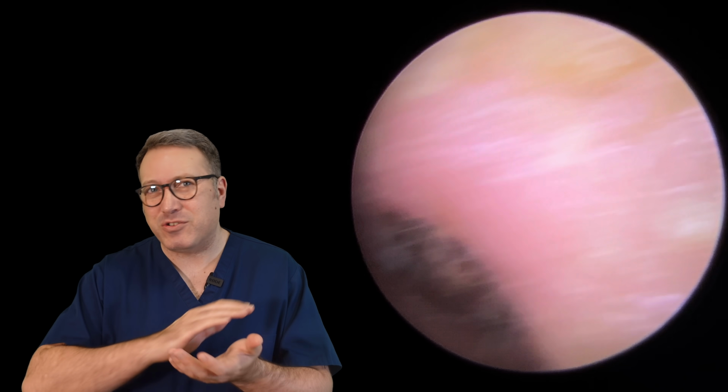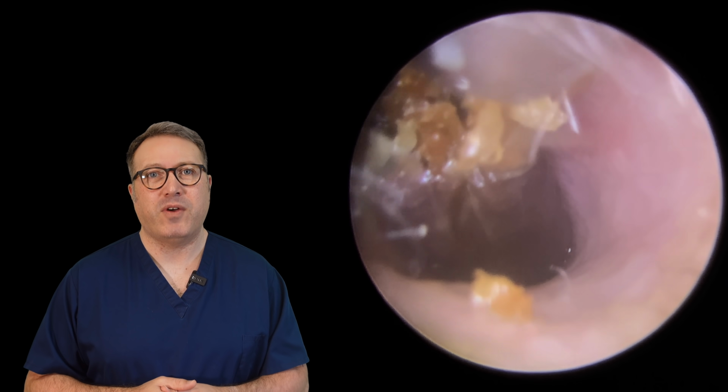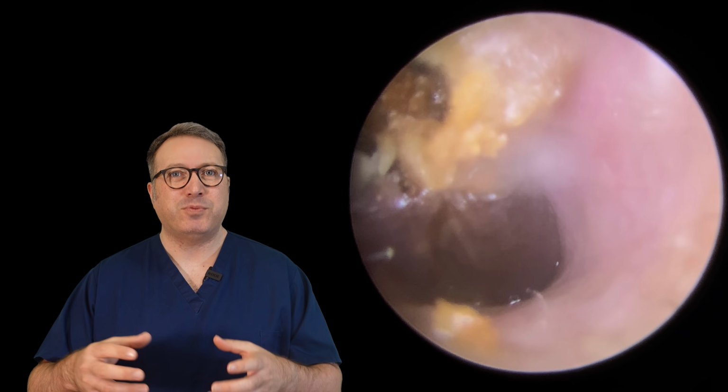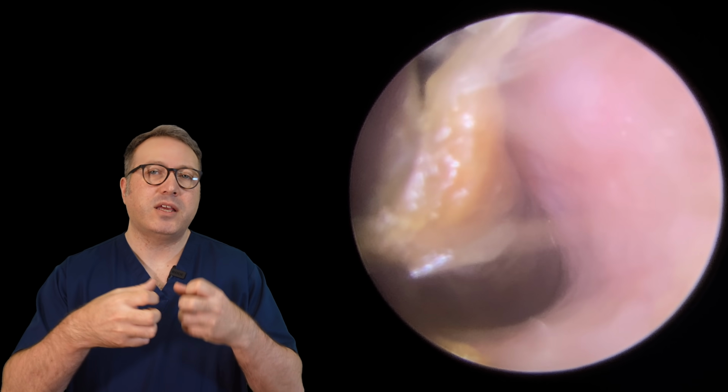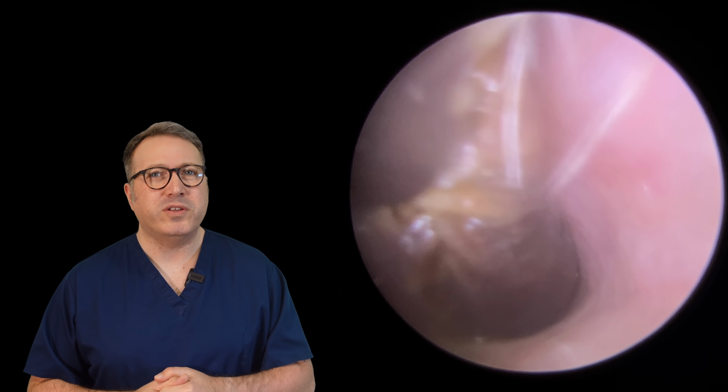That's just still shearing. Always difficult, this tougher skin material to get away, especially not so bad if it's detached, because you can actually use the strength of the skin against itself and pull it away. But when it's still attached like this one is, always difficult.